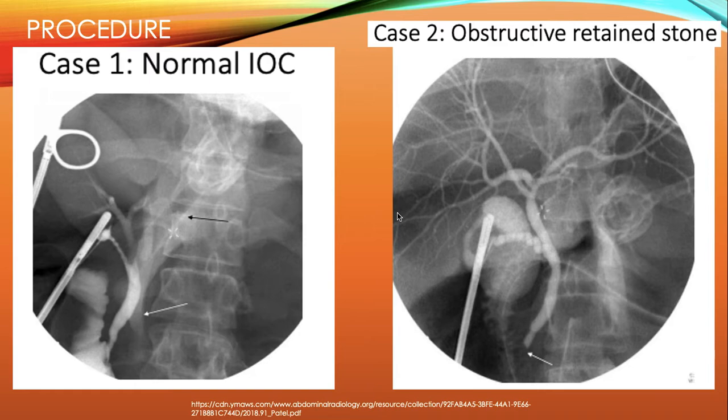At this time, a cholangiogram catheter of the surgeon's choice can be advanced into the cystic ductotomy and secured with a clip, balloon, cystic duct holding device, or umbrella mechanism. Once the cholangio catheter is secured in place, the mobile C-arm will be covered in a sterile drape and positioned over the right upper quadrant of the patient. The bed, which should be able to accommodate a C-arm, can be adjusted to have the patient in a Trendelenburg position and slightly to the right, which may facilitate placement of the C-arm. Respirations can be held after discussion with the anesthesiologist to obtain an image.